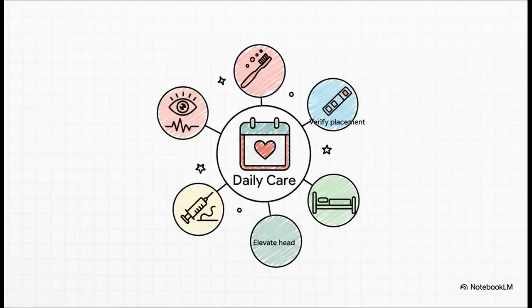And these are your daily must-dos. You have to verify that placement every single time before you use the tube. Always keep the head of the bed up. Flush the tube before and after meds to keep it from clogging. Keep a close eye on your patient for any signs of trouble. And please don't forget mouth care. It makes a world of difference for their comfort.